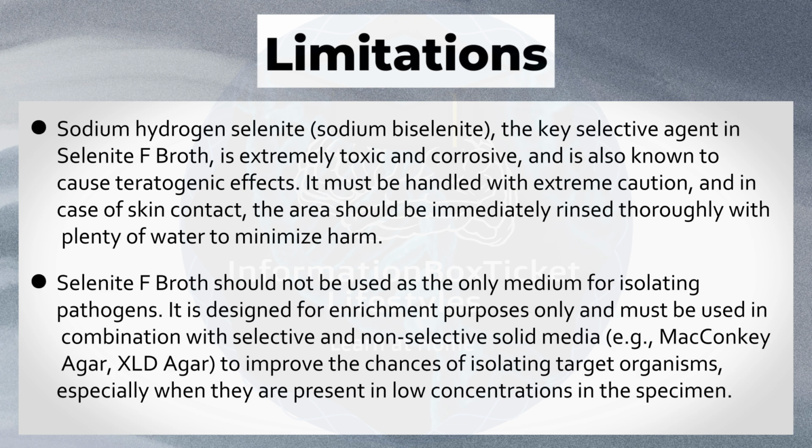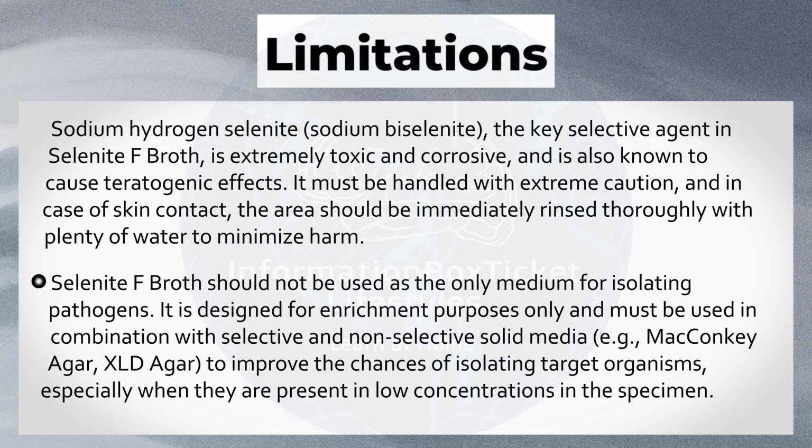Selenite F broth should not be used as the only medium for isolating pathogens. It is designed for enrichment purposes only and must be used in combination with selective and non-selective solid media, e.g., MacConkey agar, XLD agar, to improve the chances of isolating target organisms, especially when they are present in low concentrations in the specimen.